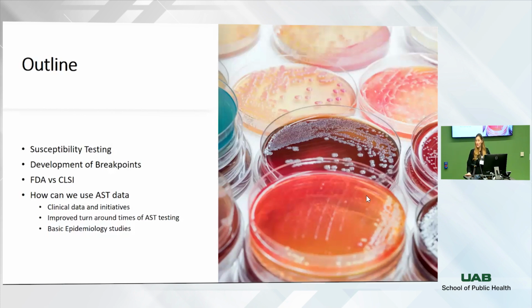So for those of you that don't do susceptibility testing or antimicrobial resistance related infections, breakpoints are SI or R values, so susceptible, intermediate, or resistant values that are interpreted for use in the patient care world. So does this antimicrobial work against said infection? And that testing and the development of those breakpoints is how we determine that.